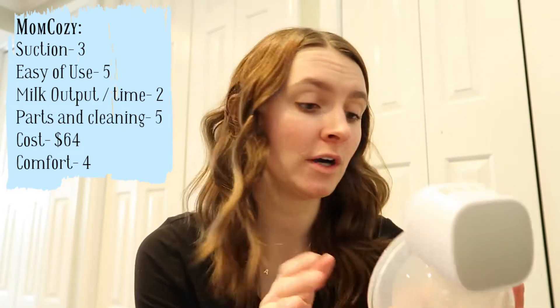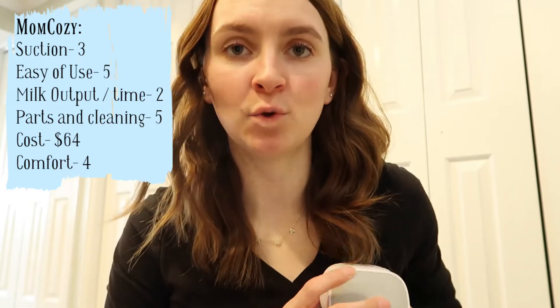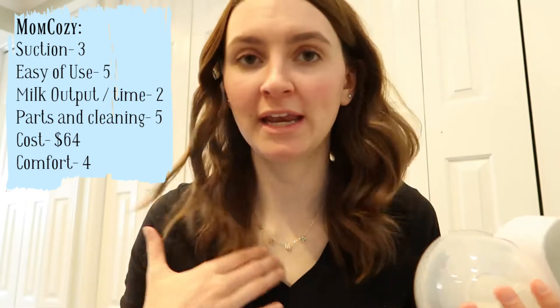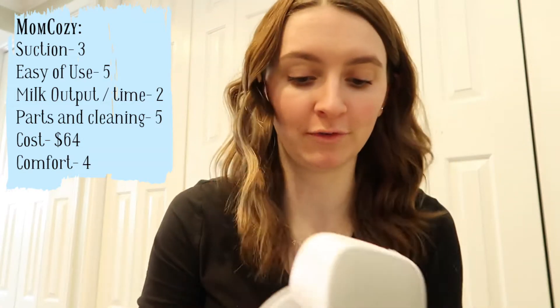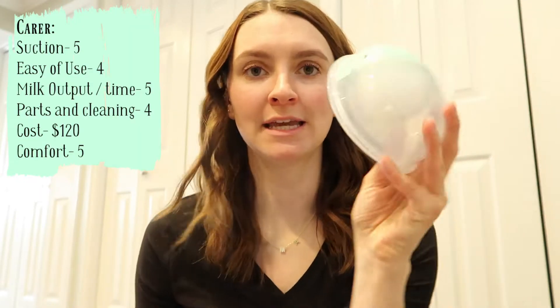Comfort is a four — very comfortable and easy to use, though this piece is a little heavy. One important note: with any hands-free pump, you cannot really bend over or move around, or the milk will spill out of the top opening.